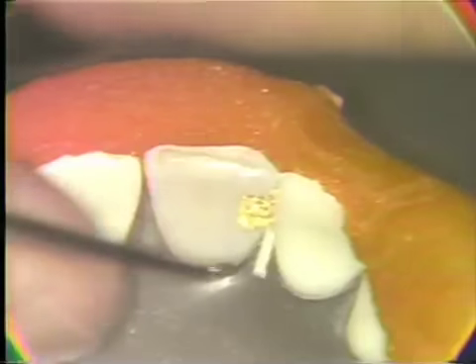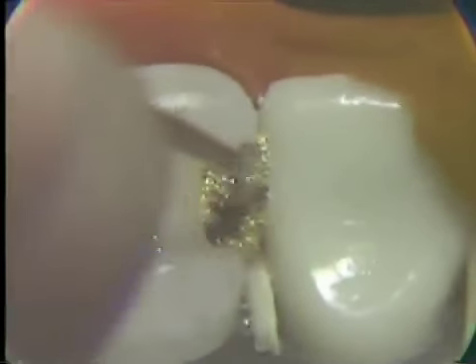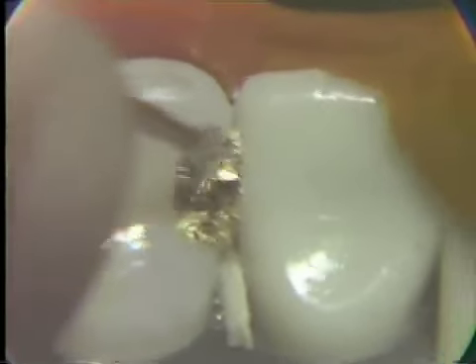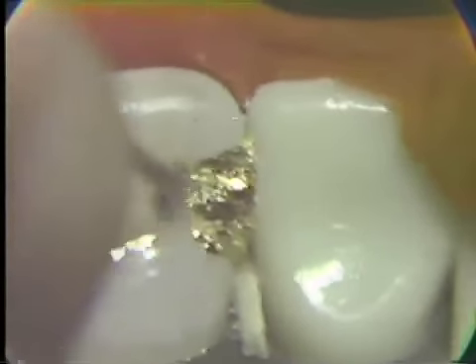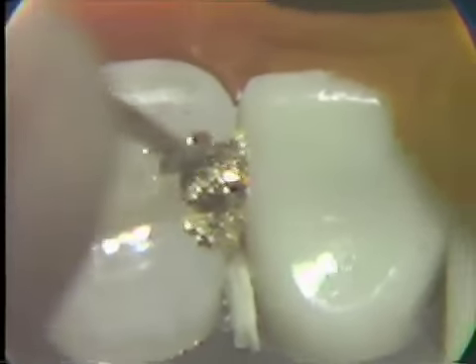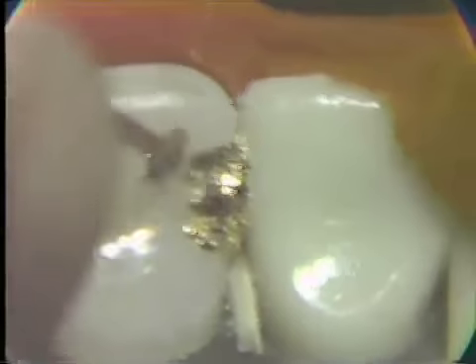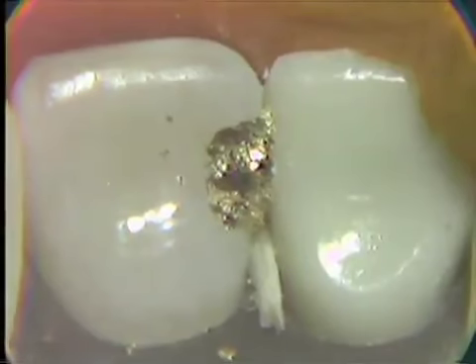The contouring and finishing is going to be initiated using the 5C carver just to remove some of the loose excess material from the surface of the restorative material. This really takes off some of the surface material and does clear away some of the excess from the cavity margins also. We'll move from this into rotary instrumentation, using a carrot-shaped stone in order to rotate that stone from restoration to tooth tissue.